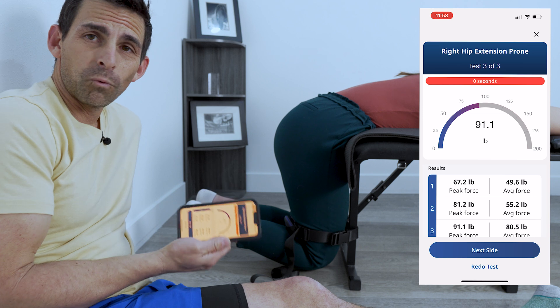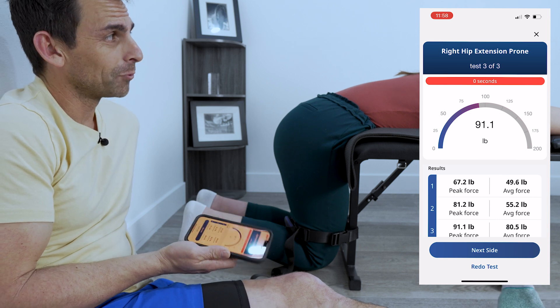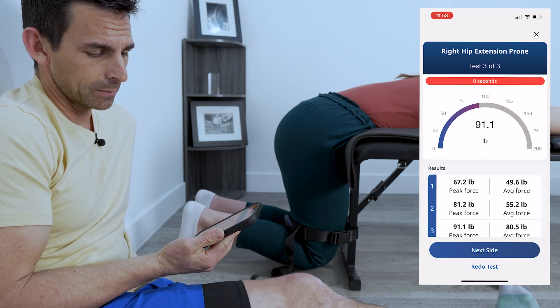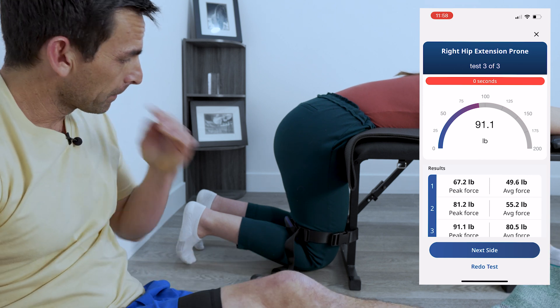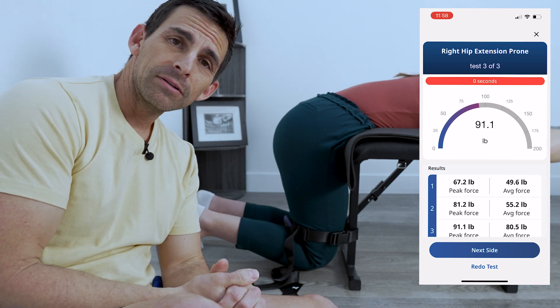You guys should note that we didn't warm up before this, so we probably would normally do that, but that's probably why her first reading was 67.2 on the peak force scale. So we're going to take this off now and change it to knee extension.